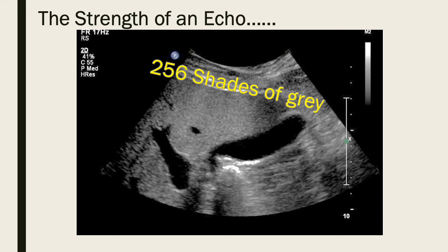Now, there's definitely going to be things that influence just how strong an echo is when it comes back to our transducer. For example, how far did the echo have to travel to return back to the transducer? So how much was it already attenuated? And what was the acoustic impedance difference between the two boundaries and the tissue type?